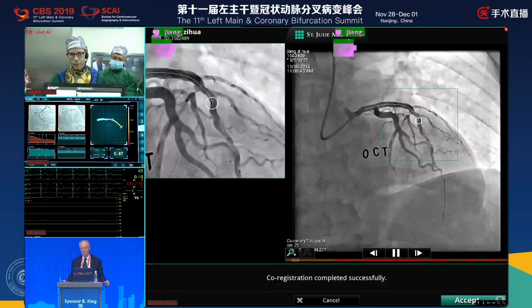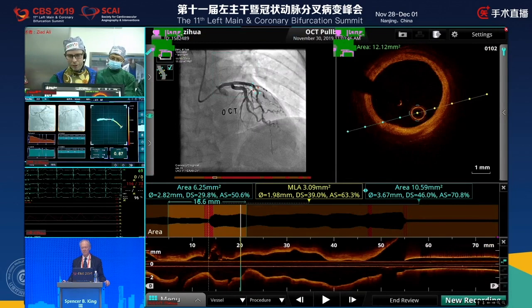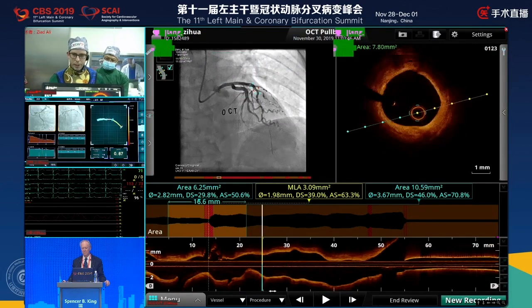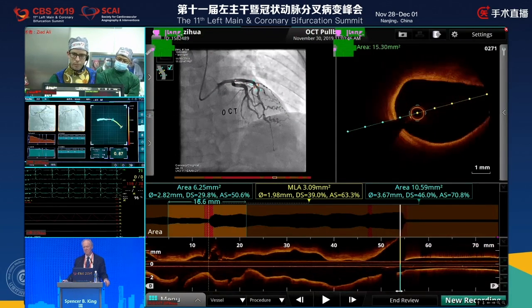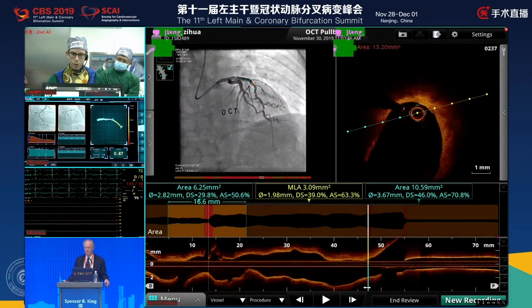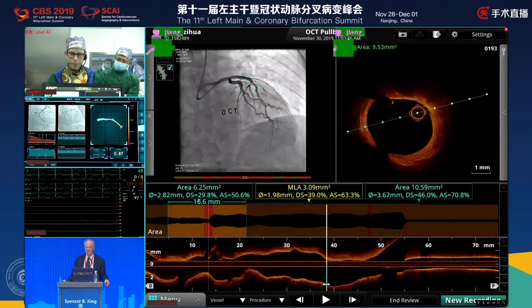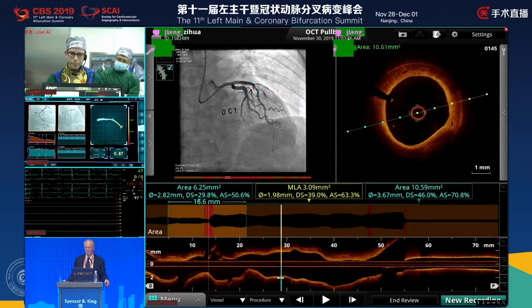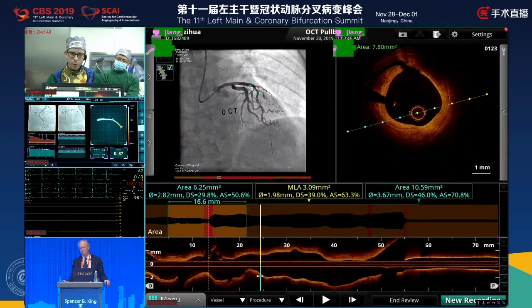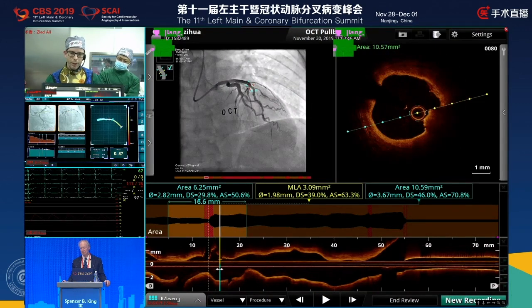And we can see here, we have a bit of a jump here, but it's not in the region of interest. We will go here, have a look at the vessel. We can see from proximal, here we have the guiding catheter, we have the circ taking off at 7 o'clock, a bit of diffuse disease, first diagonal branch, and then we can see mostly fibrotic disease with a bit of lipid, small vessels in the vessel wall. And then we approach the segment here.